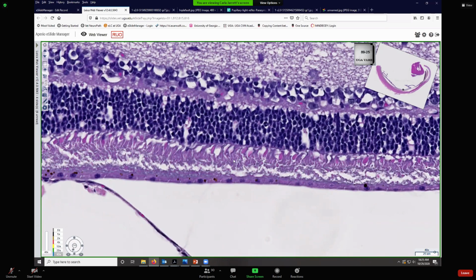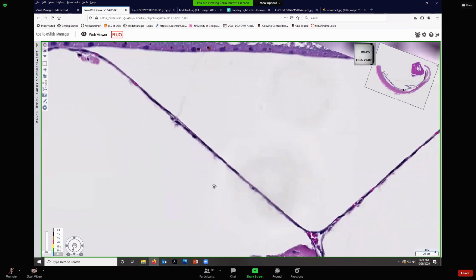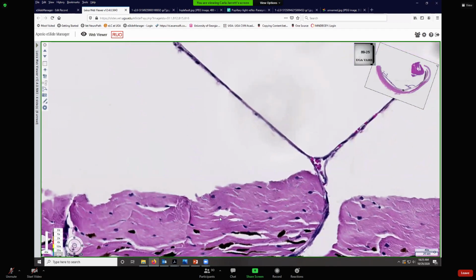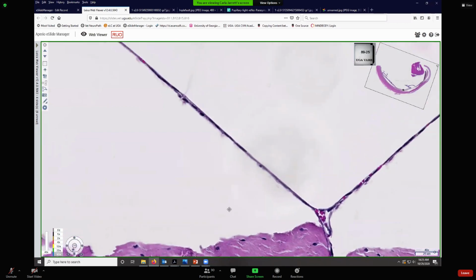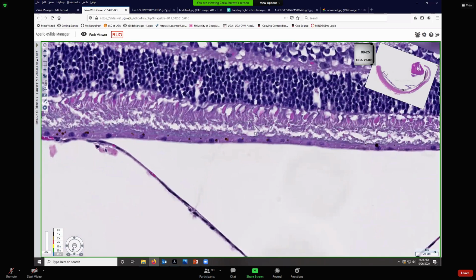If that doesn't happen, it'll pass through that retinal pigment epithelium, pass through the capillary bed, hit the tapetum, and bounce off of it like a trampoline. The photon of light is coming back, going to penetrate through and try to excite one of these photoreceptor cells. So that is the purpose of the tapetum.